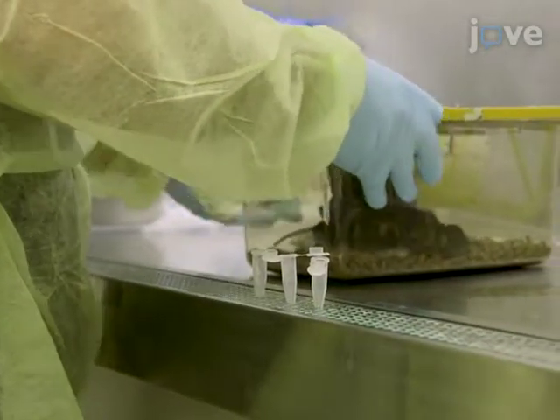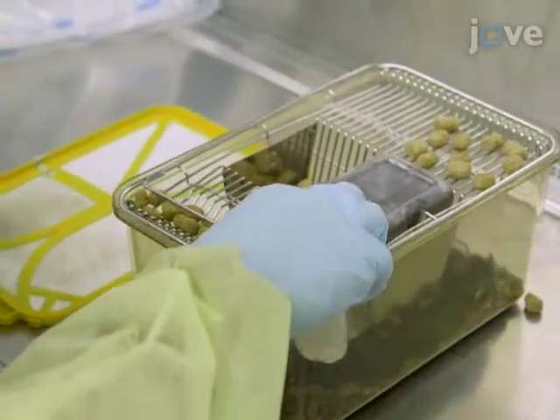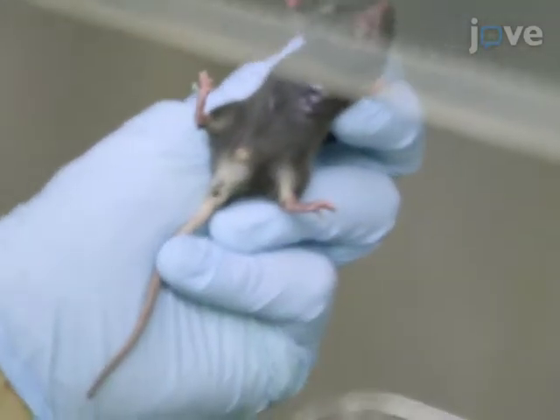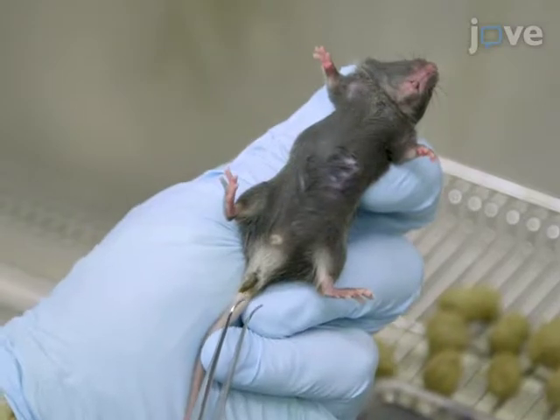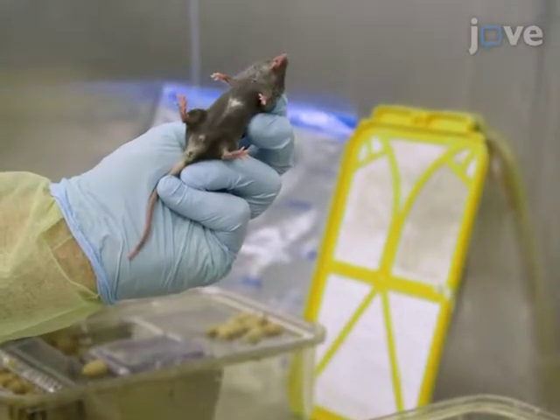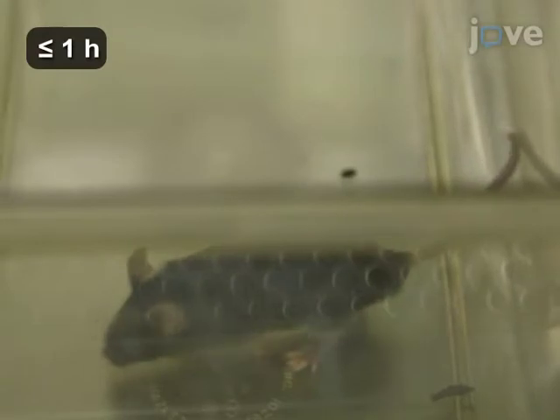Start collecting stool 1 or 2 days before euthanizing the mice. Always collect at the same time of day. To collect stool from live animals, carefully scruff the animal over a clean cage. Then, collect the defecated stool using sterile forceps and transfer it to a sterile microfuge tube. If an animal does not immediately defecate, place it into a clean cage and wait for the animal to defecate, which can take up to an hour.